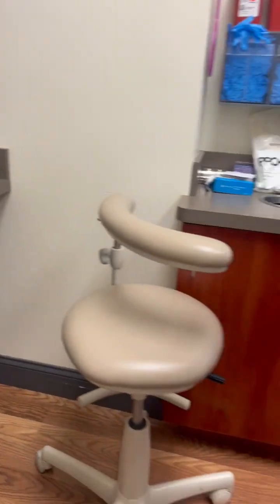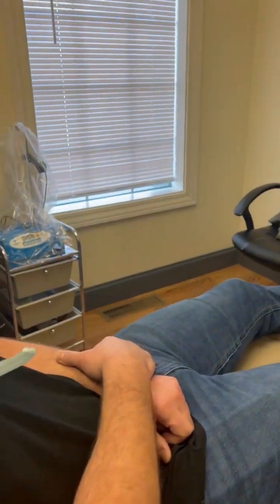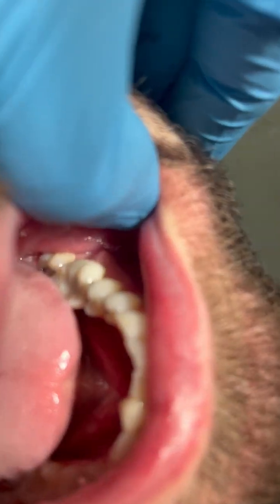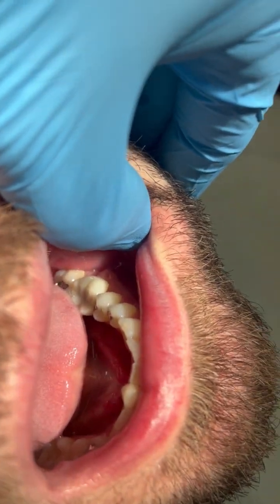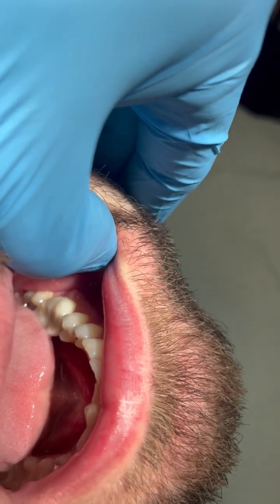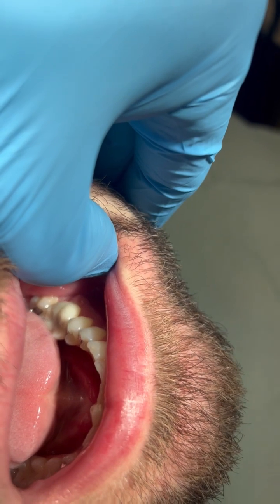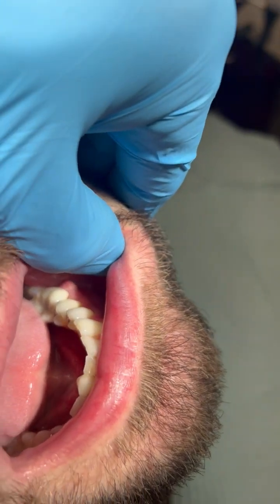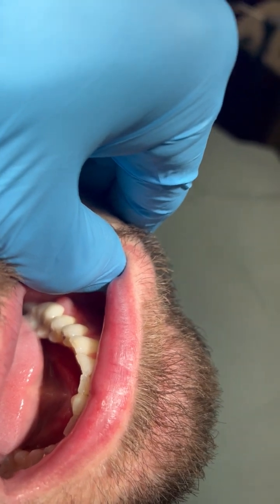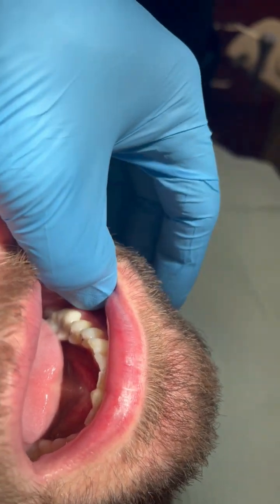Now I want to look at something clinically real quick for the patient. You can see here in his mouth that he has an abscess right on the buccal. You can see how big that abscess is. And that's pretty indicative of a fracture when the abscess on the buccal is more towards the crown margin, cervical furcation area. Typically, if it was an abscess that was periapical related, you would see it more in the vestibular area and it would swell more down into the lower ridge.